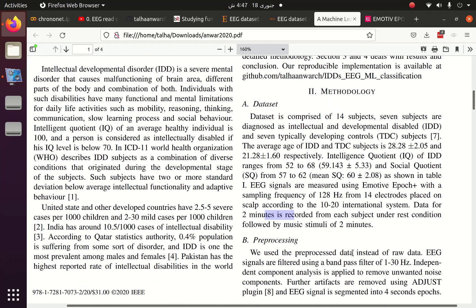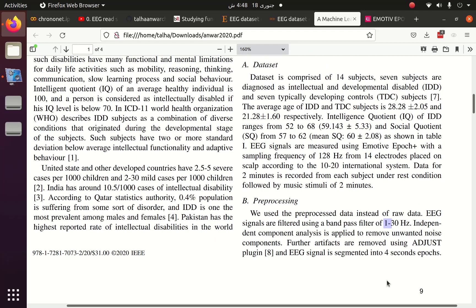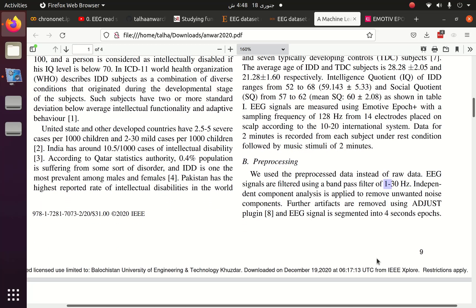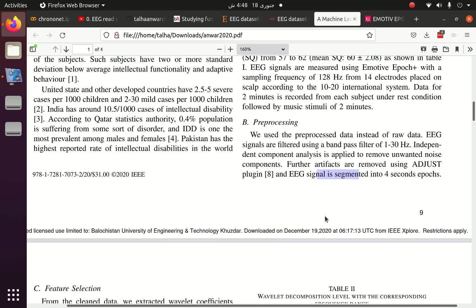Some preprocessing steps have been applied to the data before uploading. The data is filtered between 1 to 30 Hz — by default it would be 0 to 128 Hz, but the authors pre-processed it to that range. Using independent component analysis (ICA), the authors removed unwanted noise. They also used the ADJUST plugin from EEGLAB to remove artifacts, and the EEG signal is segmented into 4-second epochs. Note that this paper uses discrete wavelet transform, but we are going to use the ChronoNet approach instead.